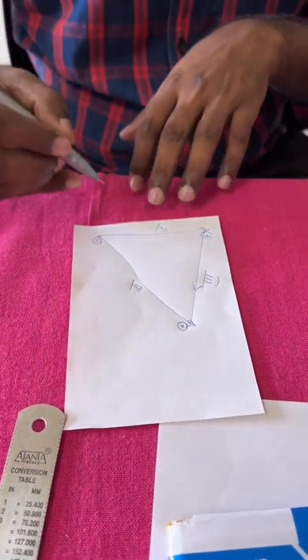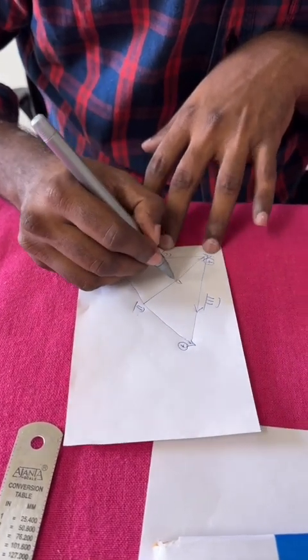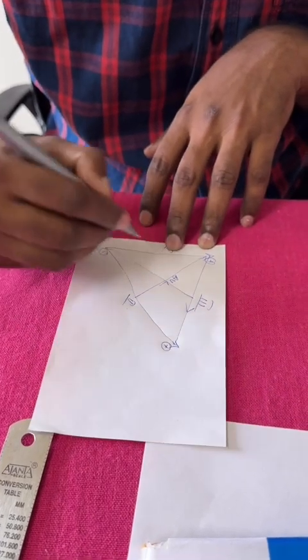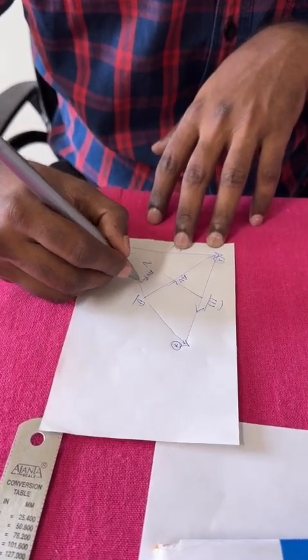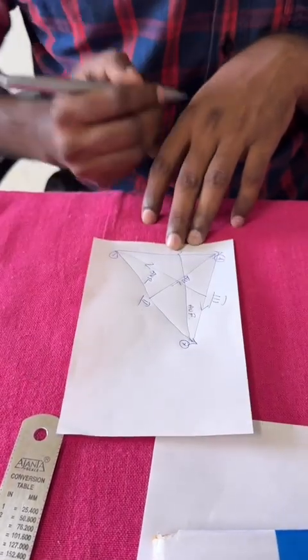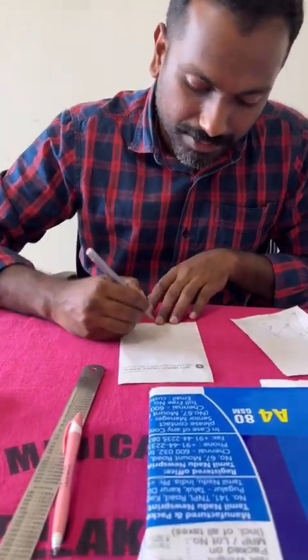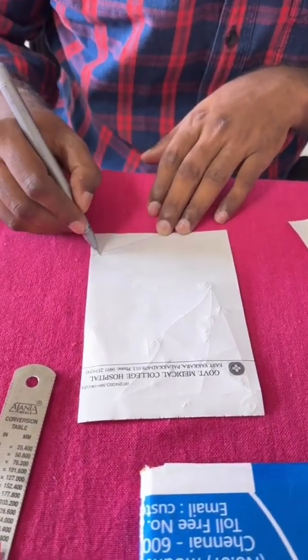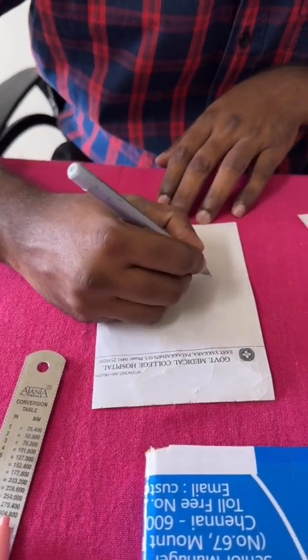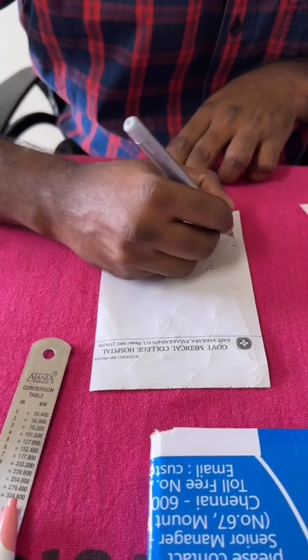Okay, and now we are having three more augmented leads. From lead 2 in this direction we are having AVL, and from lead 3 in this direction we are having AVR. From lead 1 in this direction we are having AVF. Okay, and we are also having the chest leads now. We are having V1, and here we have V2, V3, V4, V5 and V6 in these directions.